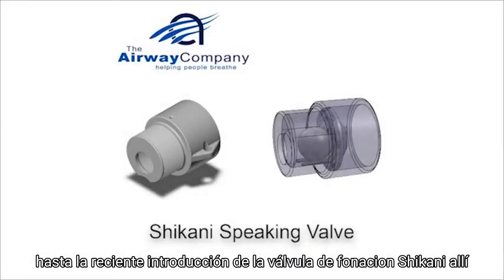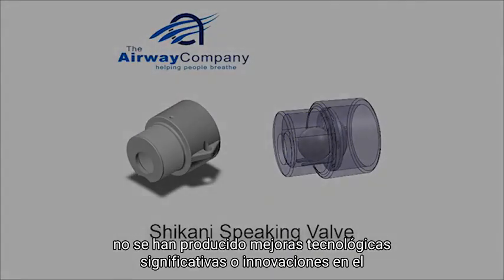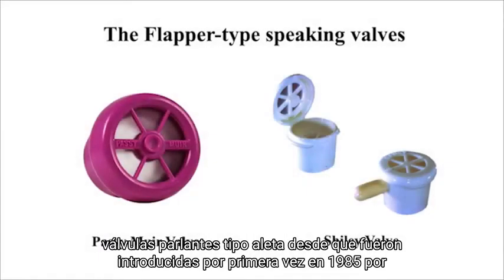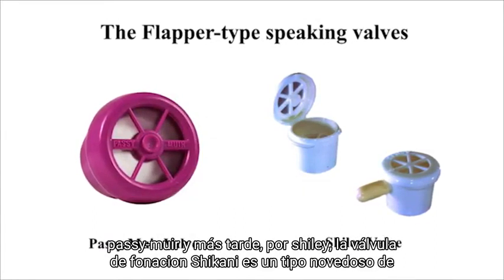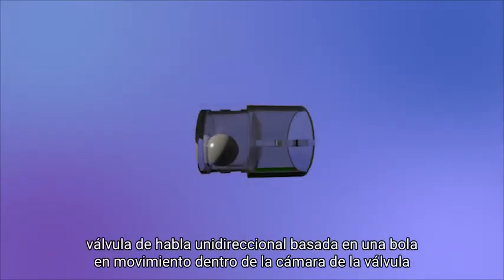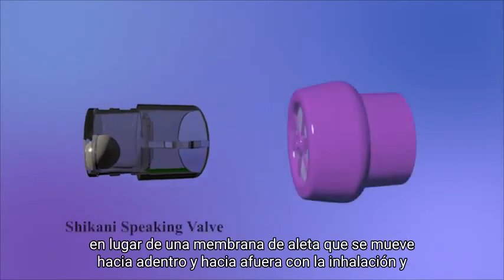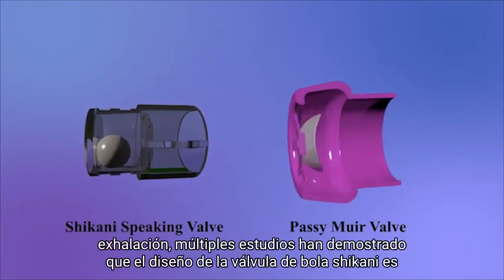Until the recent introduction of the Shikani tracheotomy speaking valve, there have been no significant technological improvements or innovation on the flapper-type speaking valves since these were first introduced in 1985 by Passy-Muir and later by Shiley. The Shikani speaking valve is a novel type of unidirectional speaking valve based on a moving ball inside a valve chamber rather than a flapper membrane that moves in and out with inhalation and exhalation.